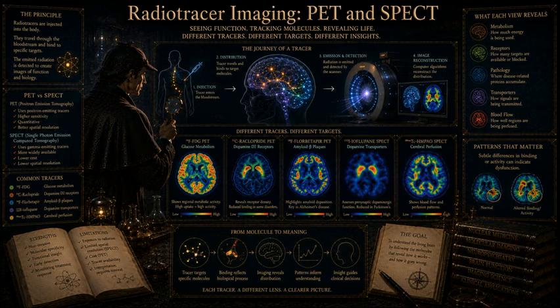It doesn't initially know exactly where on the line the event happened, but it knows the line itself is absolutely accurate. Right. Over the course of a scan, millions upon millions of these events happen, drawing millions of intersecting lines through the volume of the brain. The elegance of that is breathtaking. We are literally using antimatter annihilation to trace geometric lines through a living mind.